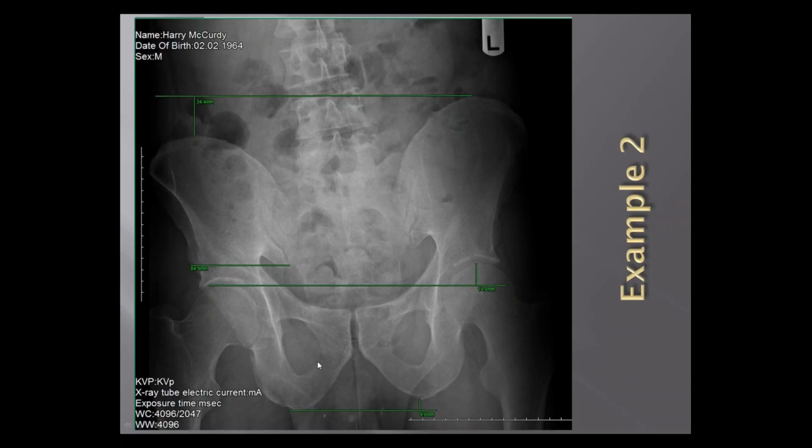Okay, good. That's exactly how we taught you how to do it, and it's completely wrong. Right, and it's completely wrong. So that's why we're here. That's why it's so important that we do this webinar, because we have recognized the fact that that is not the right way in which to measure this. And I'm going to give you guys all a tool in which you can use to do it properly tonight is my goal. We have a very simple webinar tonight and very clear. It's just about getting this right, okay?